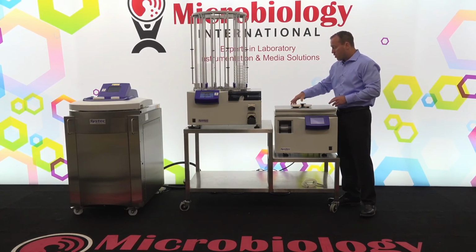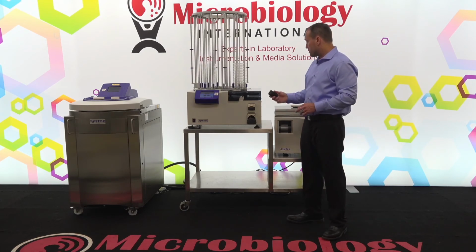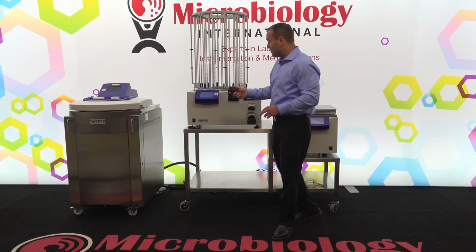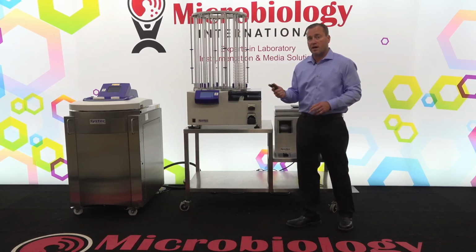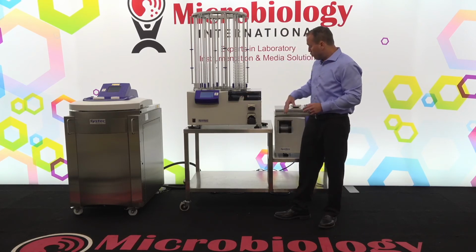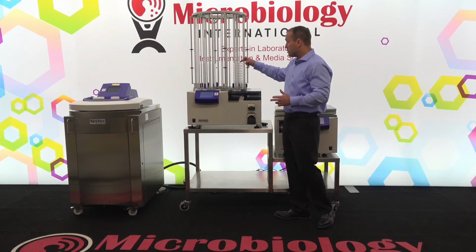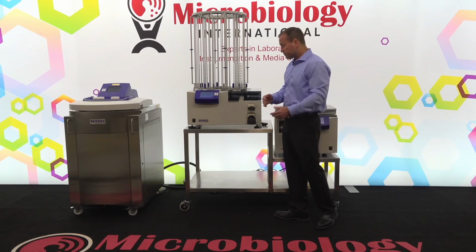So our pager is on, and once our plates are finished, it's going to stop my cycle, make a nice little noise on the MediaFill, and then it's going to send information to my pager and let me know that the cycle has been completed. Once that's finished, we can just simply remove our tubing, rinse the tubing out, and then let our plates either stay in here for drying, or we can move them for drying at another time.